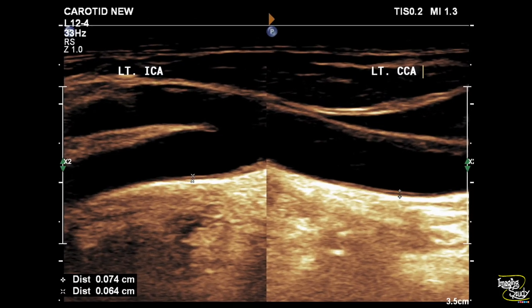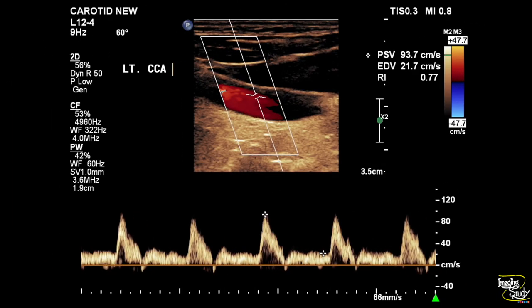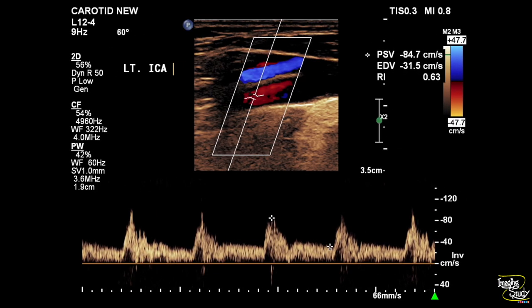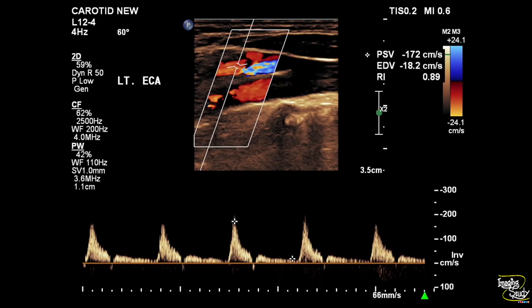Now let's look at the left side. This is the left common carotid and internal carotid arteries, which shows normal intima medial thickness. The left common carotid artery and the left internal carotid artery also show normal flow velocities. The left external carotid artery also shows increased velocity.